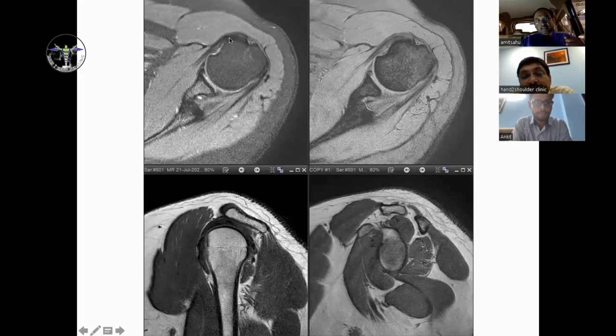This is exactly at the mid level. So this is definitely an abnormal depression of the anterior aspect of the humeral head. Now this is again the right side, also you can see this defect. Right side image, yeah. Under the subscap. Same, yeah, below the subscap.